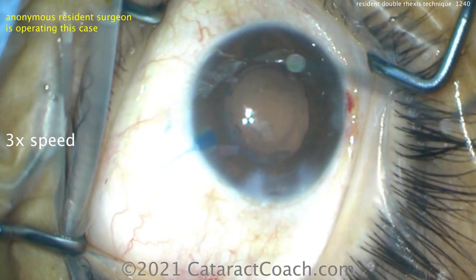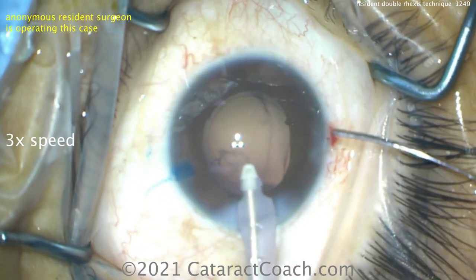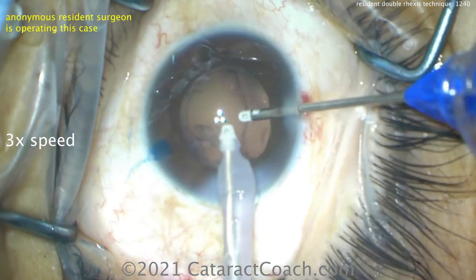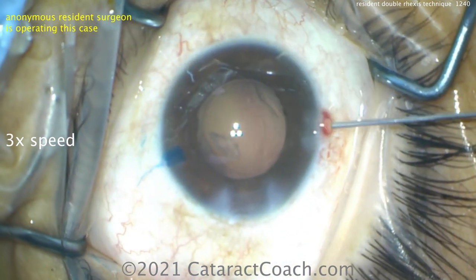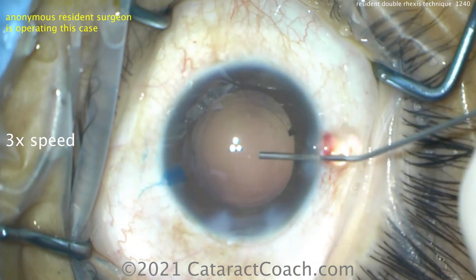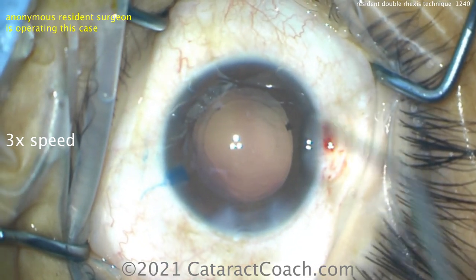Cleaning up the capsular bag pretty nicely — I like this case. Going to finish this case up just very smoothly. Nice splitting of that with the irrigation/aspiration handpiece. And now this patient is going to have just a beautiful result. Think about the preop acuity — that white cataract patient was probably at best count fingers at a foot, maybe even hand motion. And you've got the ability now to magically give that patient clear vision the next day. That's really a miracle of modern medicine.